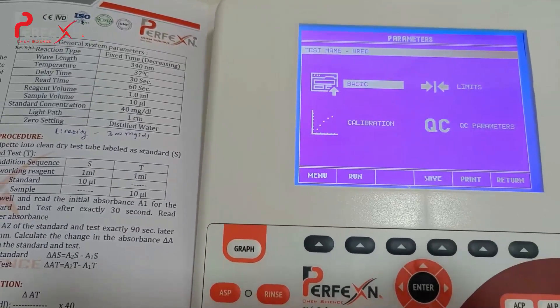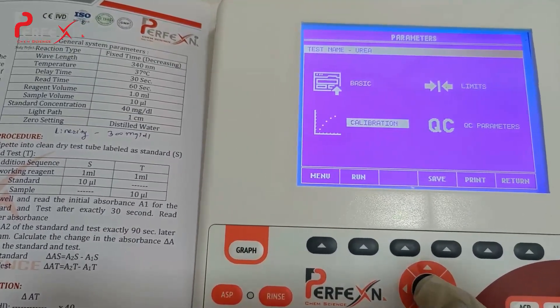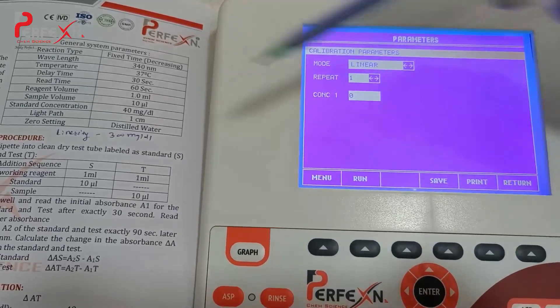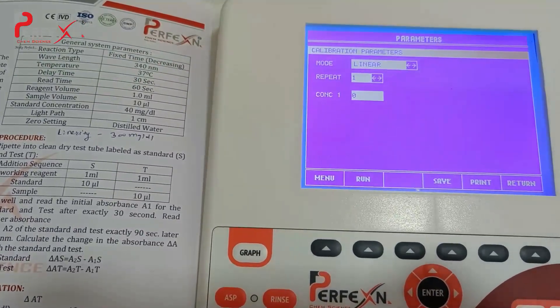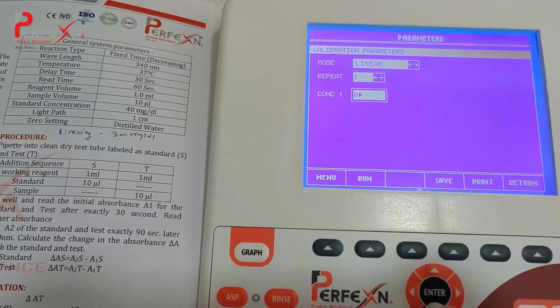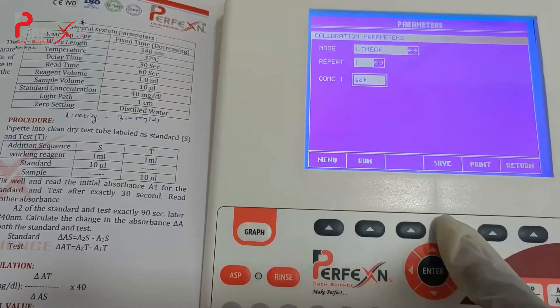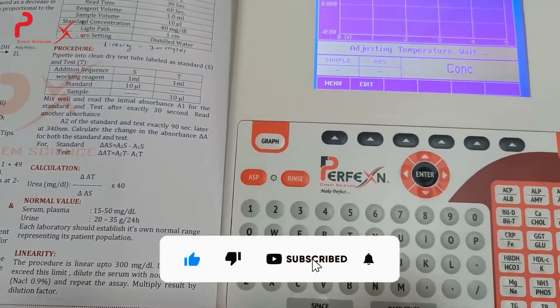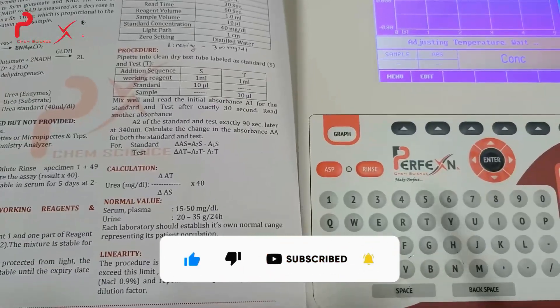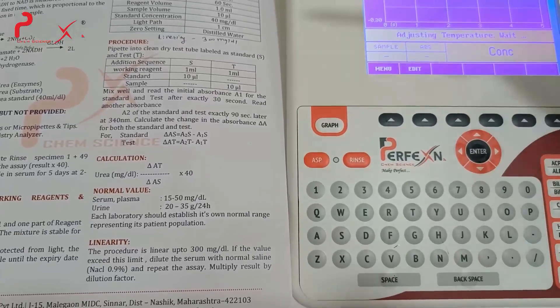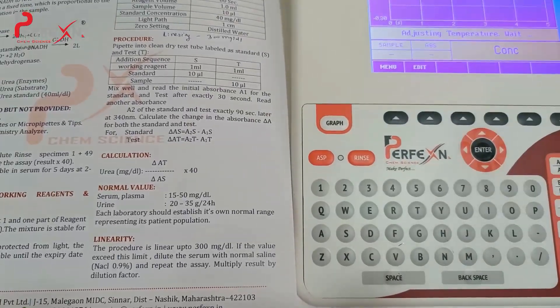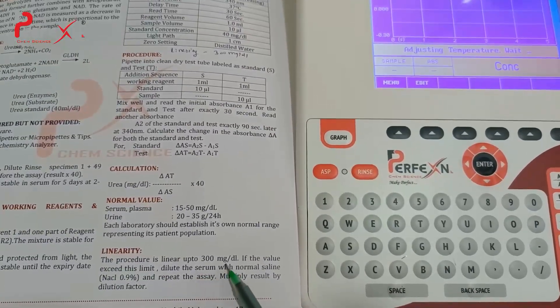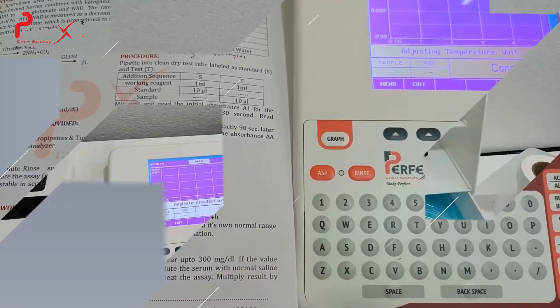Go for the calibration. Go ahead to enter the value of the urea. Here the standard value concentration is 40 mg, so enter the concentration of 40 mg. Save it and run for the test. We are performing the test of urea by the GLDH method as mentioned on the literature. The manufacturer has given the linearity range as 300 mg per dl.